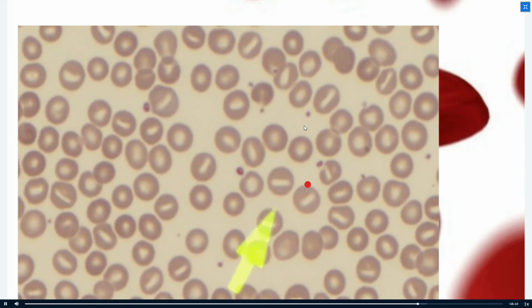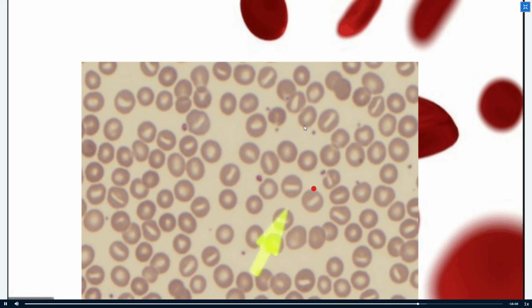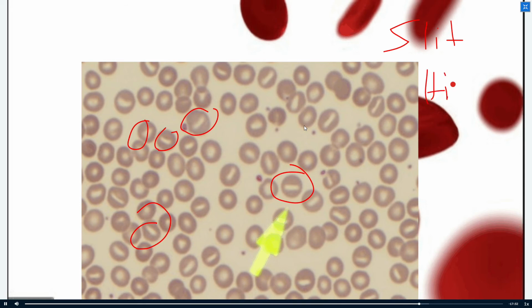Okay. They would appear like this, class. Parang hulugan ng coins. Para silang hulugan ng coins. Stomatocytes. May slit-like. Slit. Ang Tagalog, hiwa or cut. The central part of the cell.